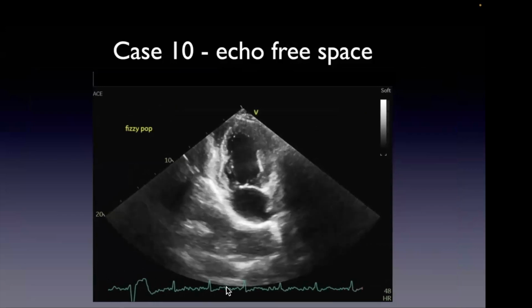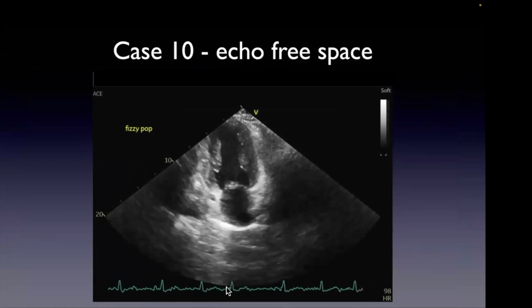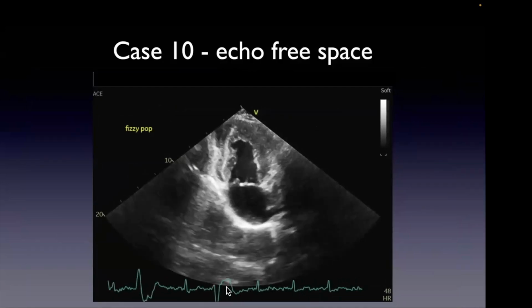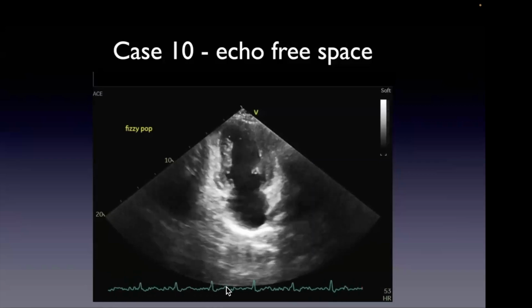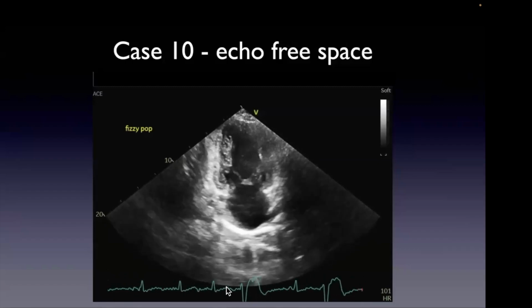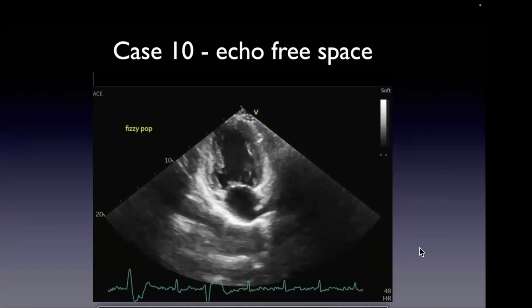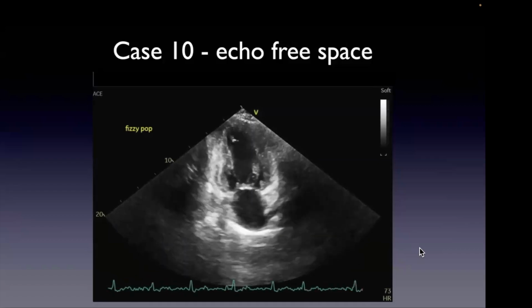So this is the carbonated beverage. This is the fizzy pop. So it's a dilated esophagus, and there's some echo density within it that we thought was retained food. Probably not the best example of a carbonated beverage scan, but I think you can see that it does opacify. So, a trick up your sleeve just in case you want to show something is connected to the GI tract.